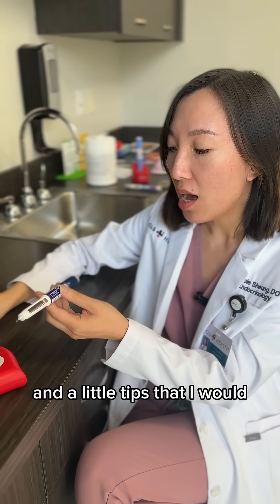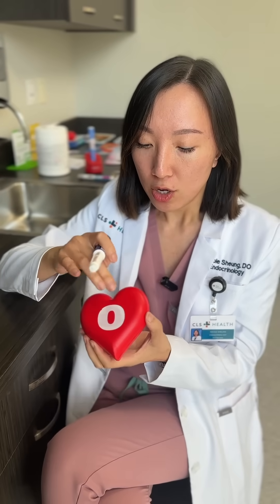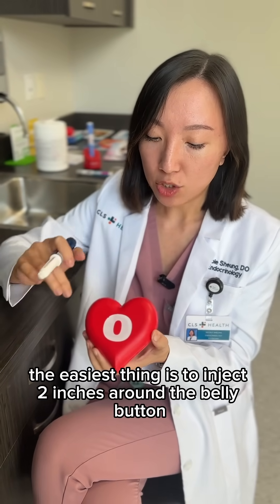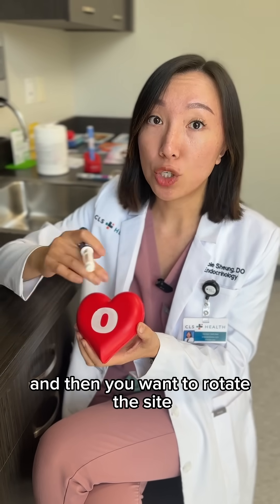Then you can start dialing up to your recommended dosage by your physician. A little tip I would tell patients: the easiest thing is to inject two inches around the belly button, and you want to rotate the site.